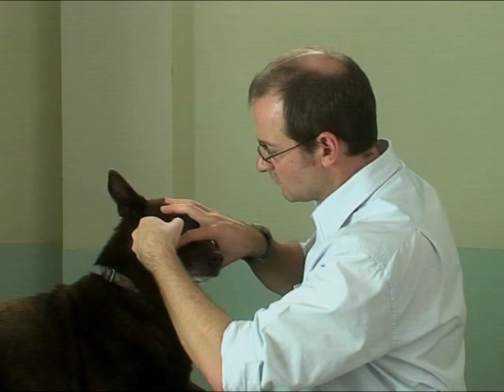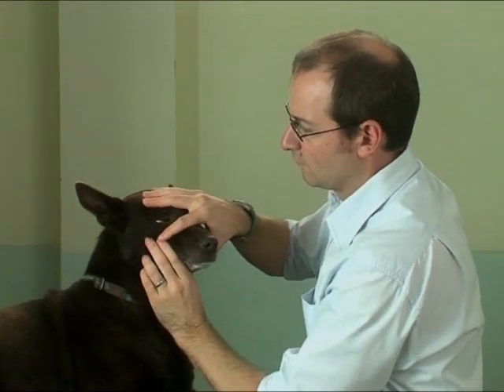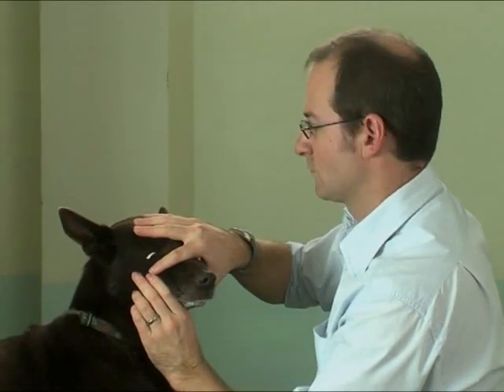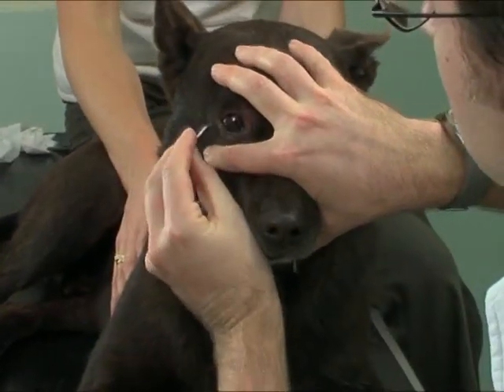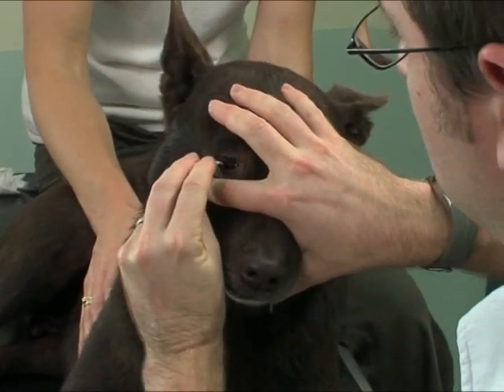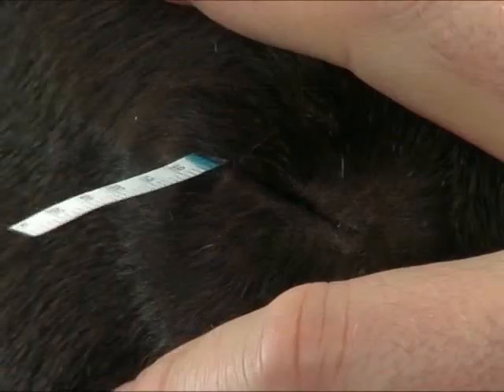The Schirmer tear test is a useful means of measuring aqueous tear production. This is crucial in cases where conjunctivitis is recurrent. If you didn't do it the first time, then you must do it the second time. You need to make sure that the tear film is intact and healthy, because it's so crucial for the health of the cornea. The Schirmer tear test strip should be inserted in the lateral half of the lower conjunctival sac.